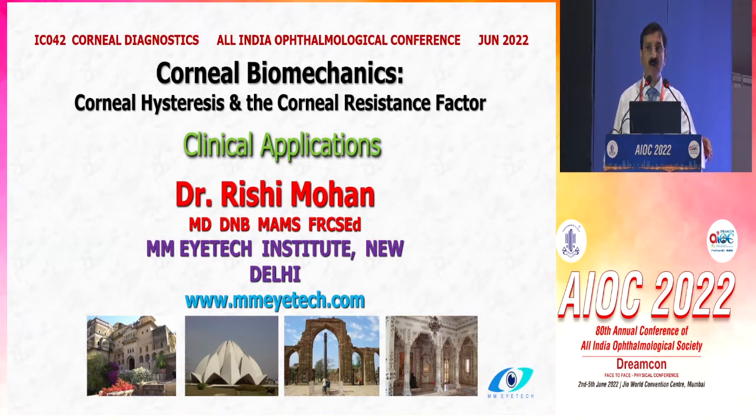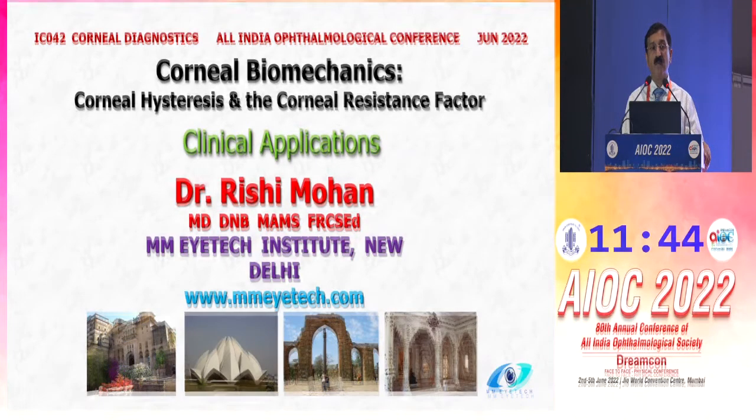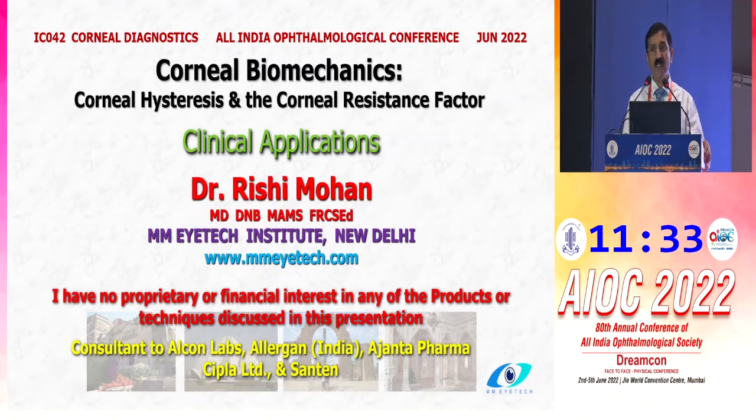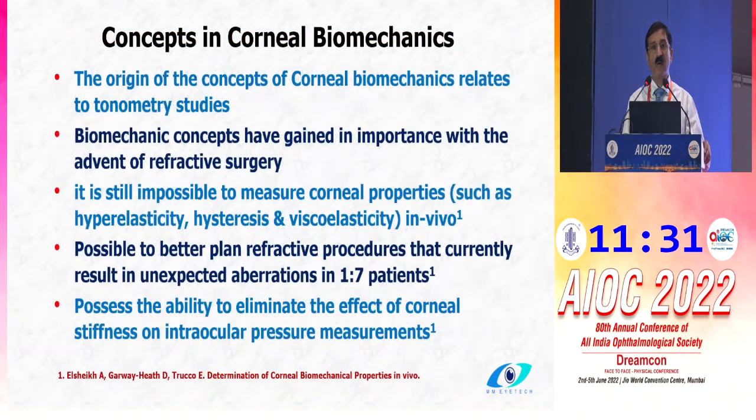So I'm going to speak about a subject that I've actually spoken of for the last 10, 15 years now, trying to build up the understanding of corneal biomechanics amongst the ophthalmologists and how important it has become. During our residencies, we all heard about the outflow facility and we heard about scleral rigidity. However, we never had a very good means or a technology which could actually capture it.